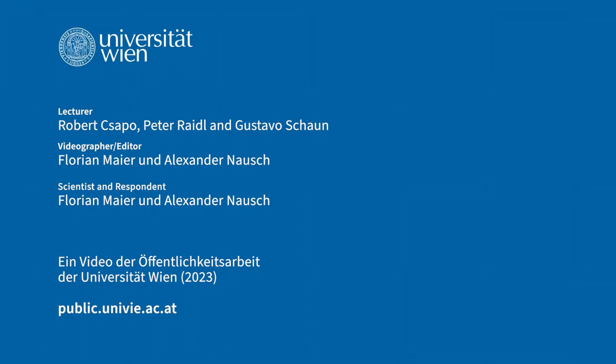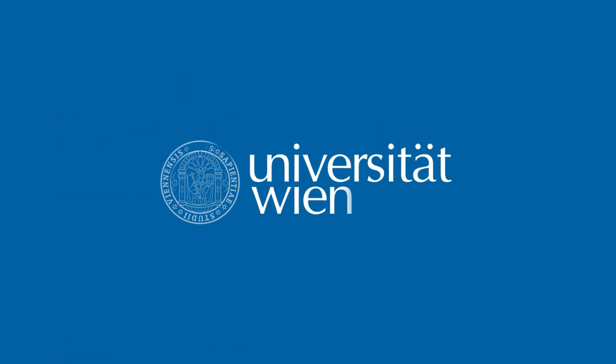Spiroergometry was carried out here as an example with a sports student in the course of a master's seminar led by Robert Sapo at the University of Vienna.